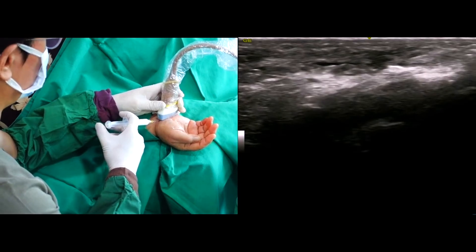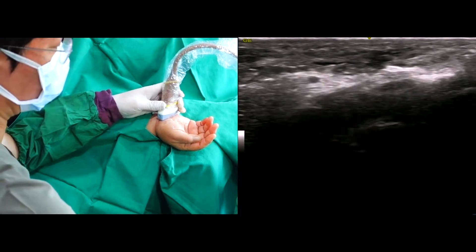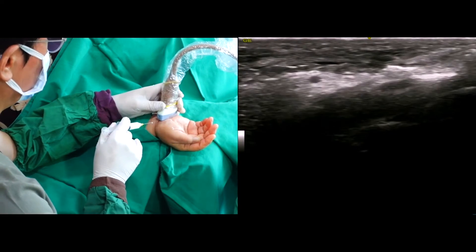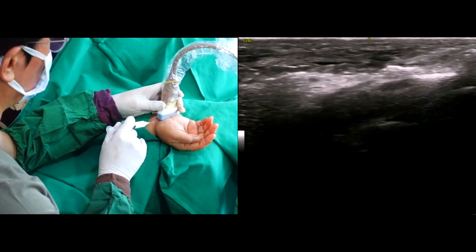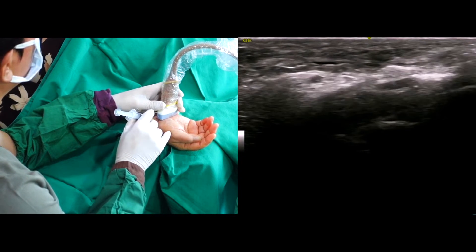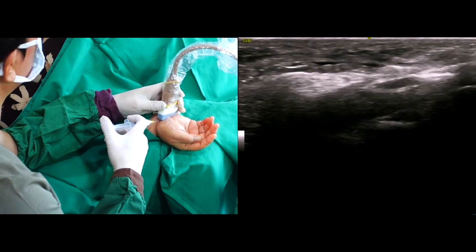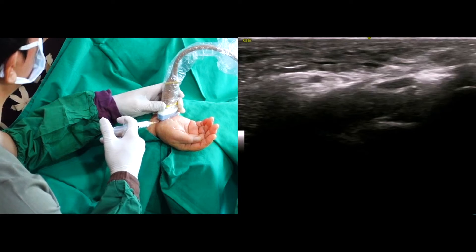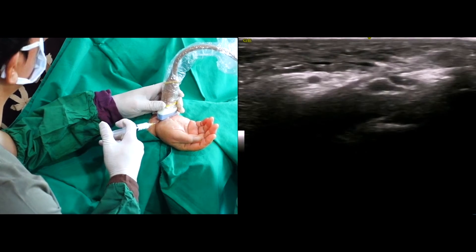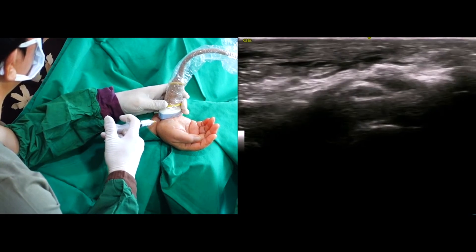I forgot to evacuate all the air from the syringe, so I will remove the air from the fluid. I will separate the median nerve from the covering tissue using fluid and hydraulic pressure.